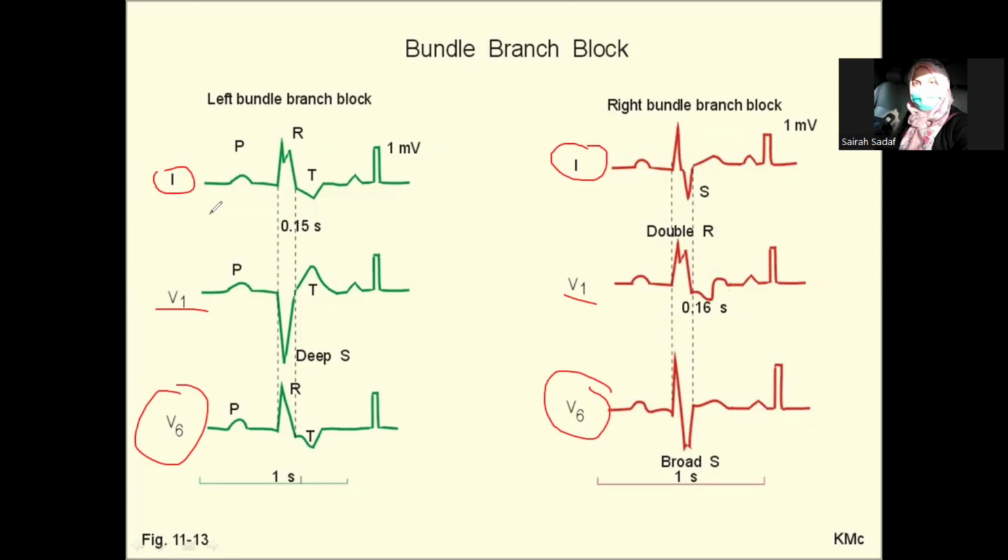And the other thing, as I have mentioned earlier, is that in left heart diseases the normal findings are enhanced, while in right heart diseases the normal findings get opposite to the normal. Okay.